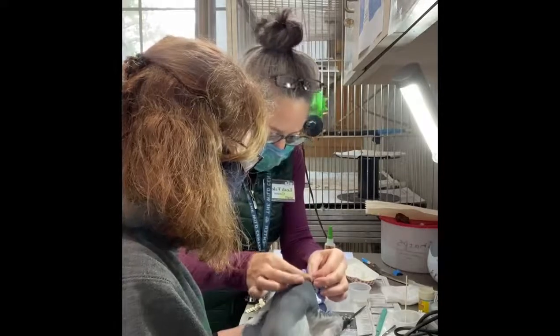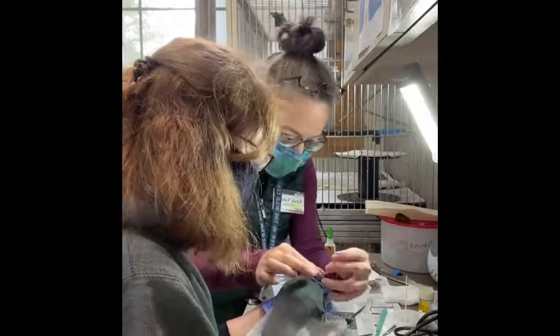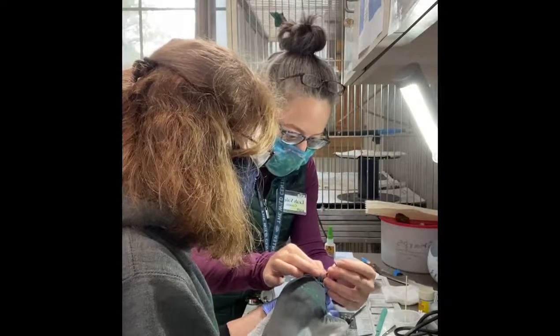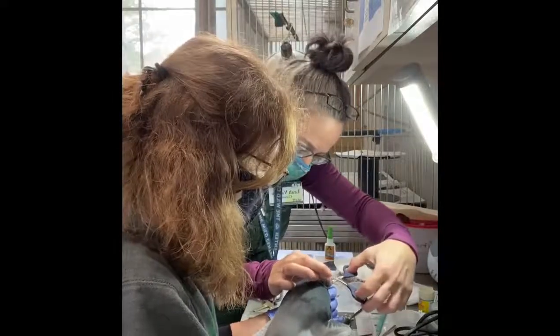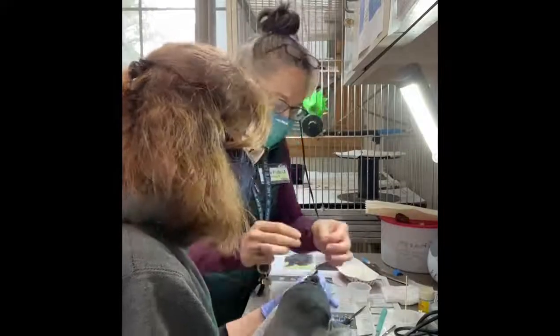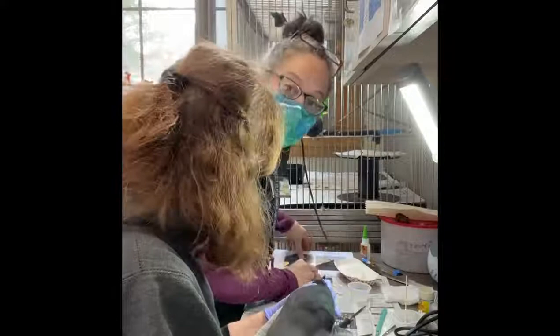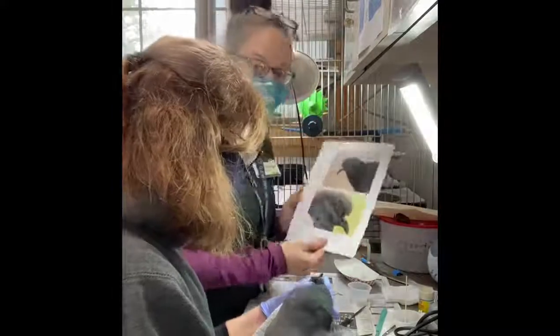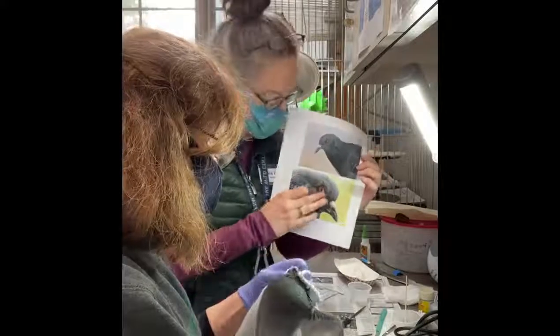Right now I'm just taking a measurement — just trying to see where I might want to glue it, and where that bottom mandible comes. One of the things we did before we started this process was I went on the internet and looked up pictures of pigeon beaks so we could have a good reference point. The bottom mandible I think is normal.